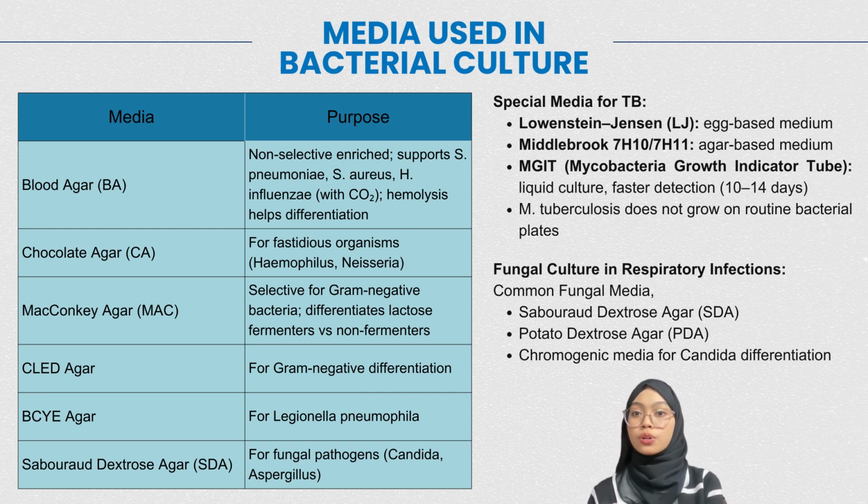BCYE agar is used for Legionella pneumophila. Sabouraud dextrose agar is used for fungal pathogens such as Candida and Aspergillus. For TB, special media like Lowenstein-Jensen, Middlebrook agar, and MGIT are required. This is because Mycobacterium tuberculosis does not grow on routine bacterial plates.